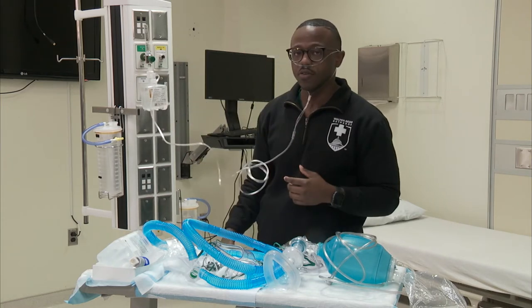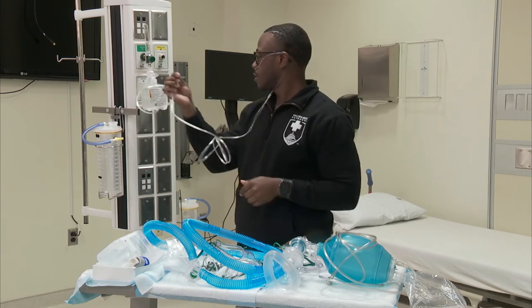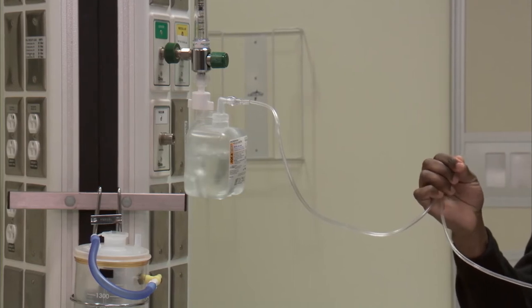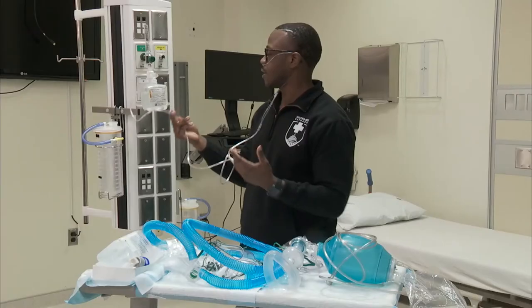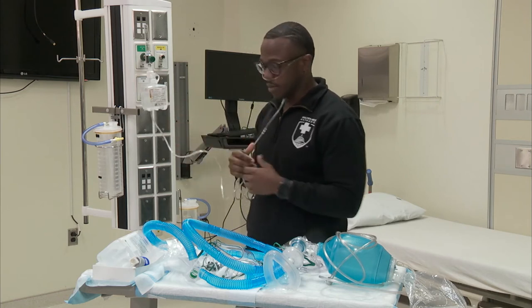If it's bubbling, you know it's working. A safety measure: if there's a kink in the system, you can see the bubbles kind of going down a little bit. Once the kink is cleared, it's flowing a little bit more. And that's your nasal cannula.